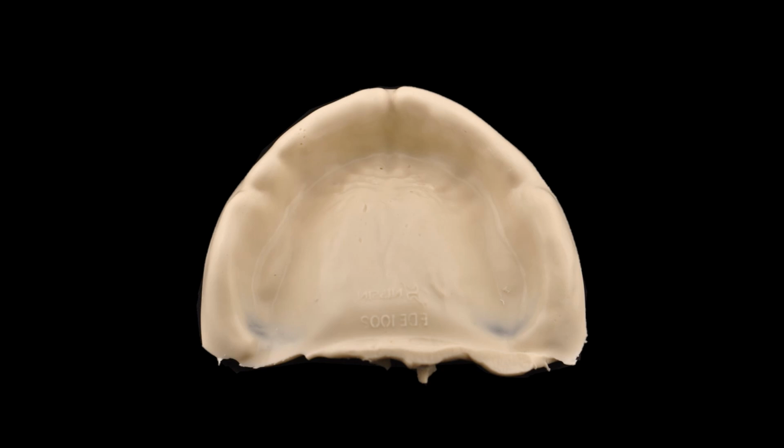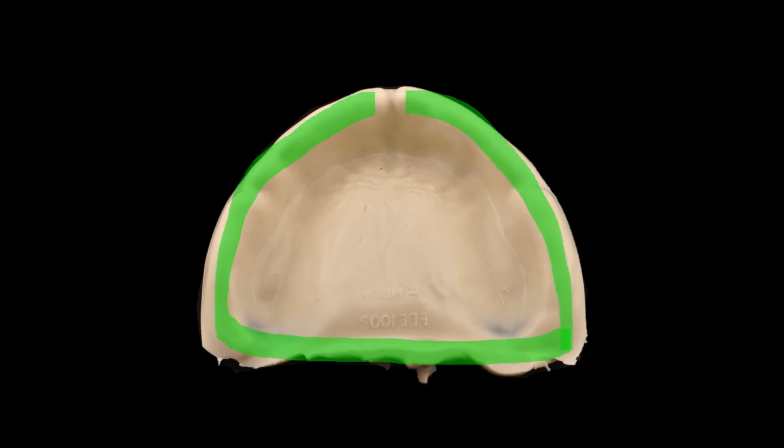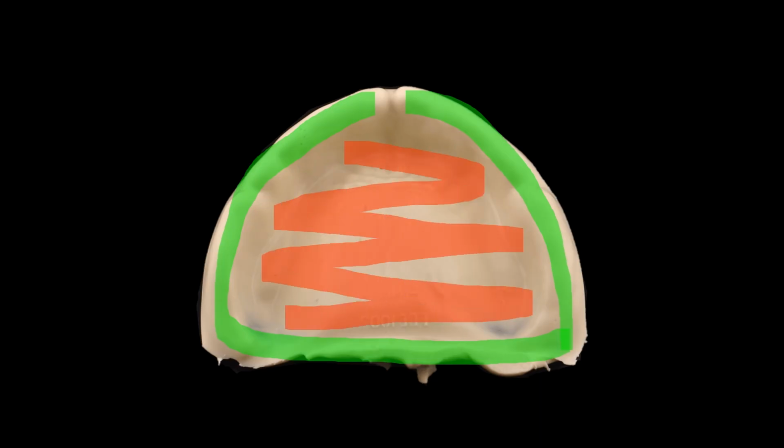Properly mixed alginate has zero to minimal presence of bubbles or voids. In the areas in green, voids equal to or less than 2 millimeters are okay to have, but the palate area should be as intact as possible, with zero to some bubbles, but less than 1 millimeter is okay in this area. Make sure you're capturing the hamular notches of your patient.